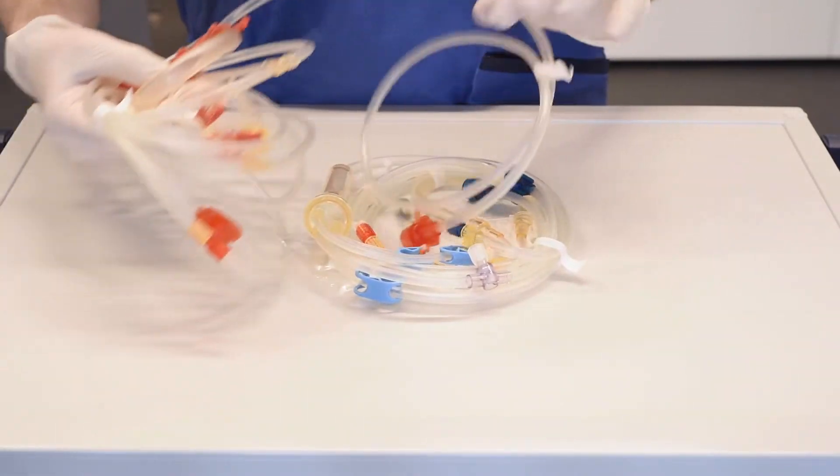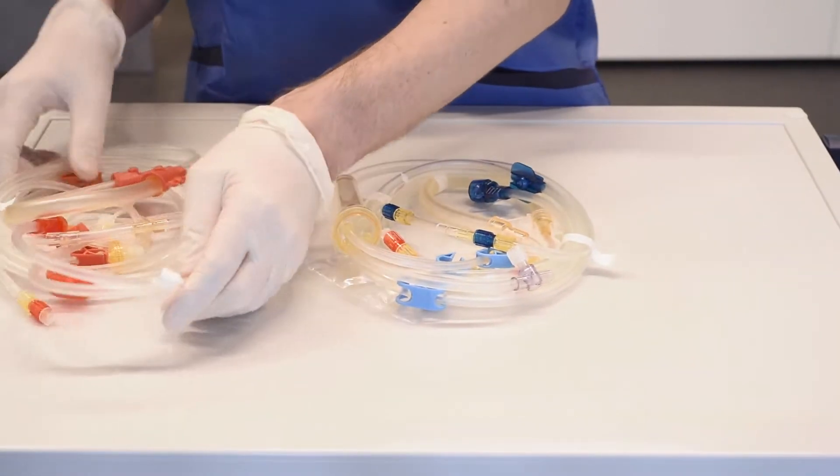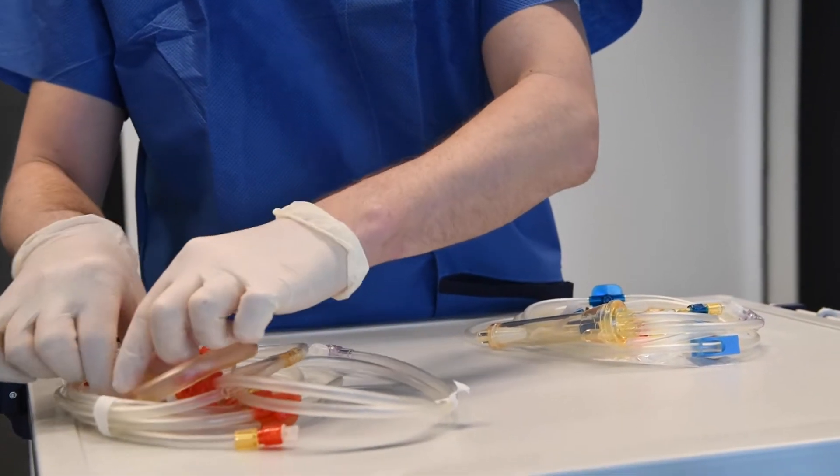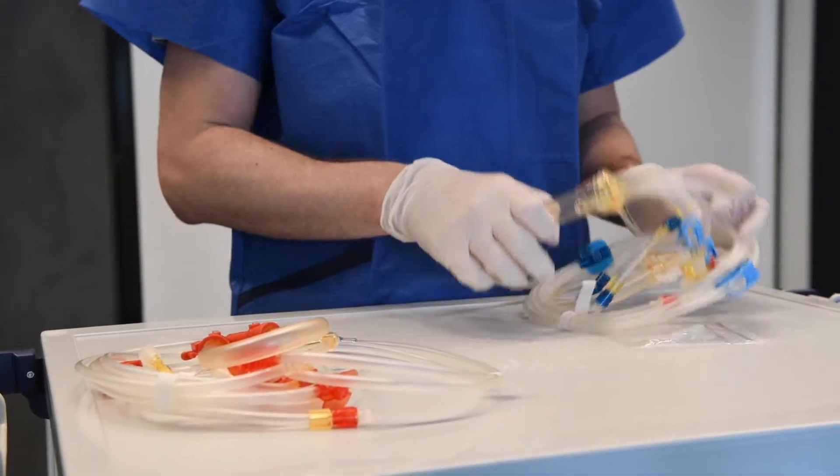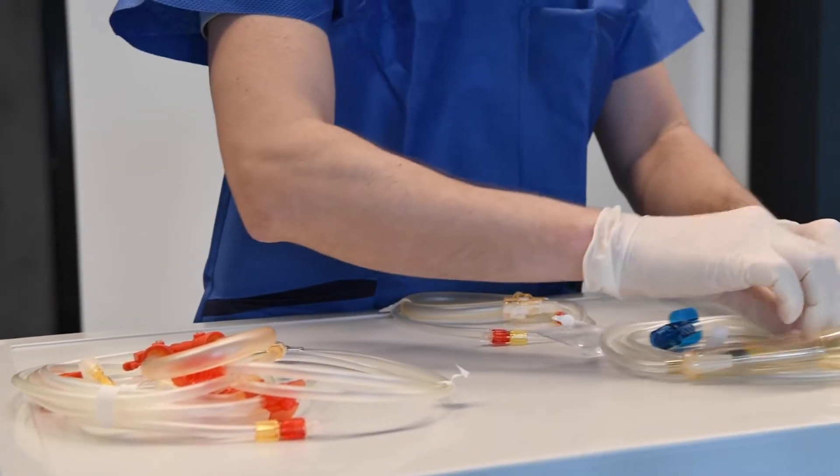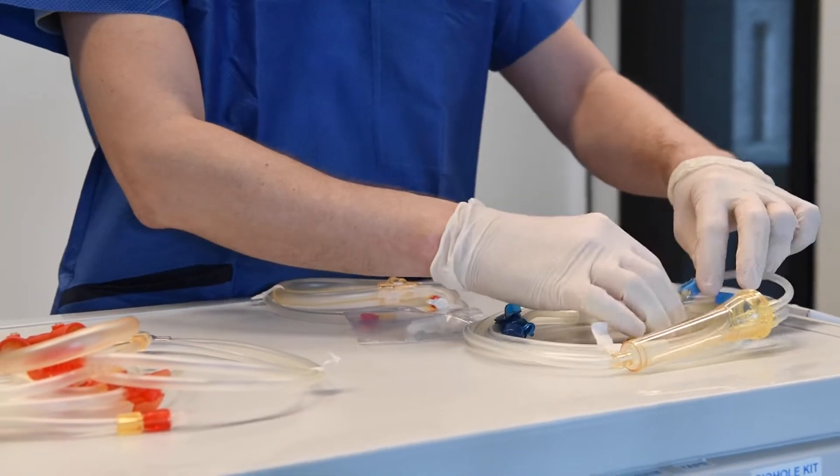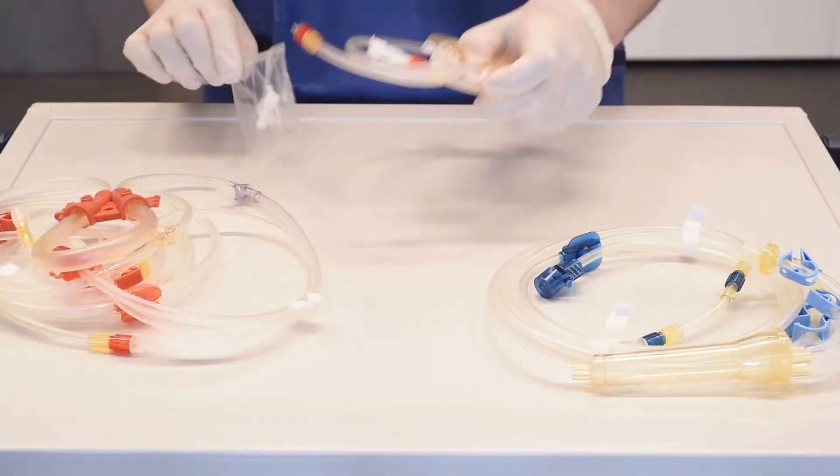The HDF bloodline consists of the arterial and venous lines, the substitution pump segment and a recirculator for reinfusion. Check the bloodline to make sure it is ready for use and the connectors and caps to make sure they are not loose.